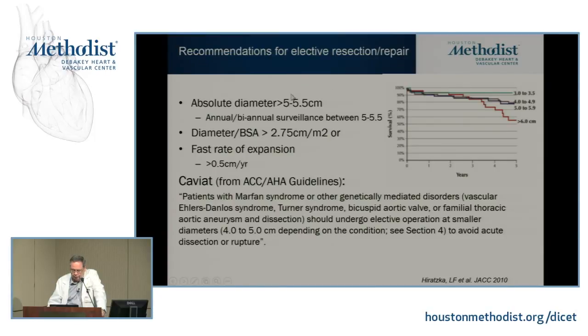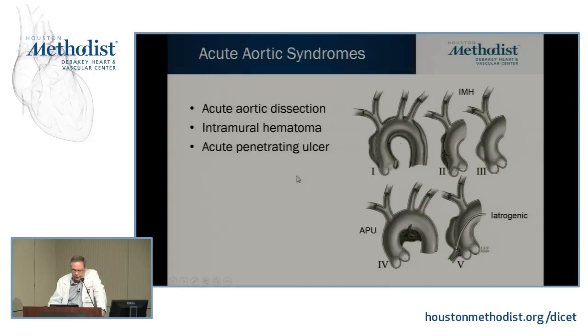And you already talked about this, so I'm going to pass about the recommendations for surgery. And you know already about these three entities. What I like to do is spend a little time on how echo can guide you with them, just because when you finish your practice and you go to practice in other places, you may not be as blessed as we are here with outstanding CT and CMR. Remember that the CT that FAISAL showed you is gated CT. Very important. You didn't use that term, but I like to stress it. It's what we do here.